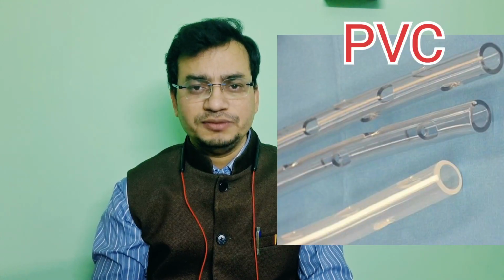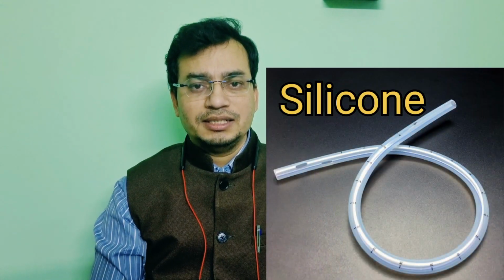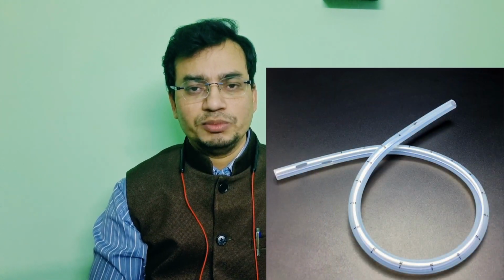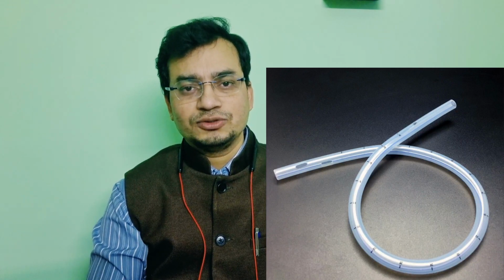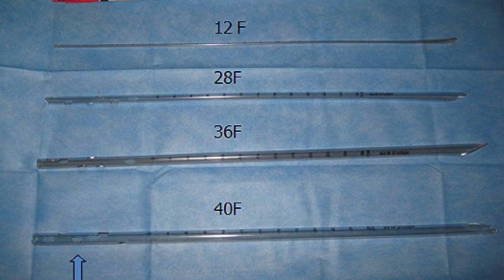The material of this tube is usually polyvinyl chloride or PVC, polyethylene or silicone. The PVC is commonly used because it is cheaper. Silicone is softer, associated with lesser pain and drain site infection, but costly material to make such tubes. Different sizes of the tube are available from 6 French to 40 French. Smaller tubes are meant to treat pneumothorax and less thick pleural effusion. Larger tubes are ideal for drainage of hemothorax or empyema. 28 French or larger are needed for the drainage of blood or pus in the adults.